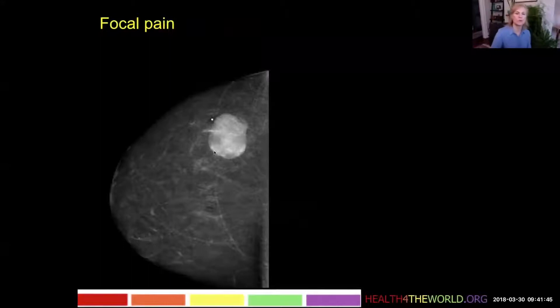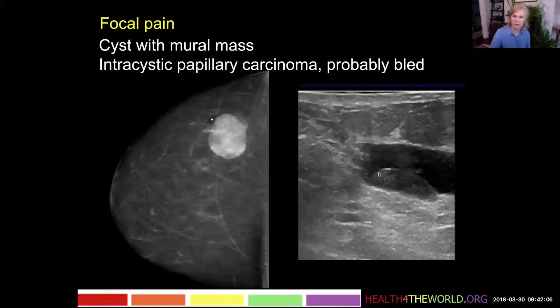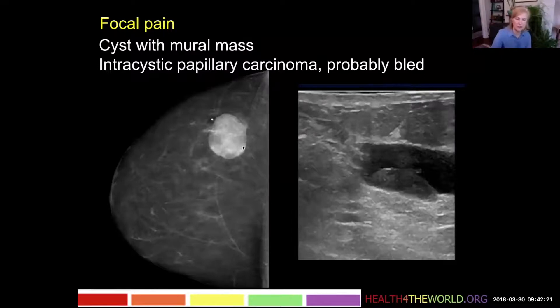Here's another patient who had focal pain. On her mammogram we see a round or oval mass with circumscribed margins, not terribly dense but with some areas of increased density. Sonographically we see a complex cystic and solid mass — here's the cystic component, and here's the solid component, a mural mass. This is another intracystic papillary carcinoma. Probably what happened is it bled, which is what caused it to be painful — an example of a cancer presenting with focal pain.